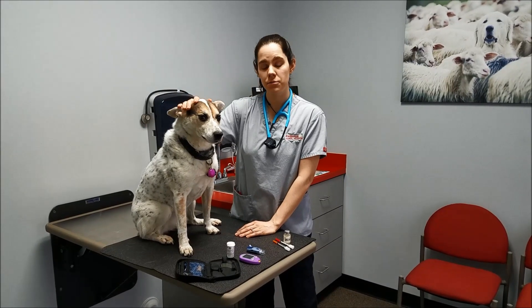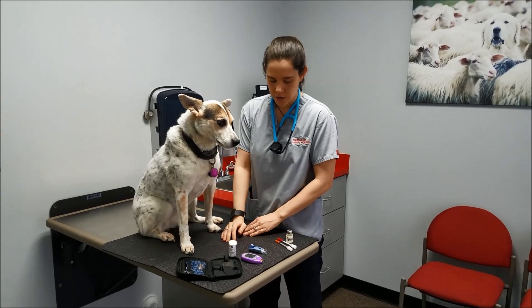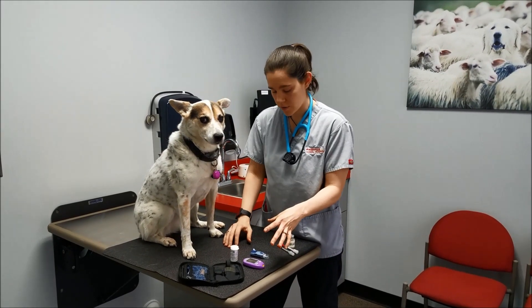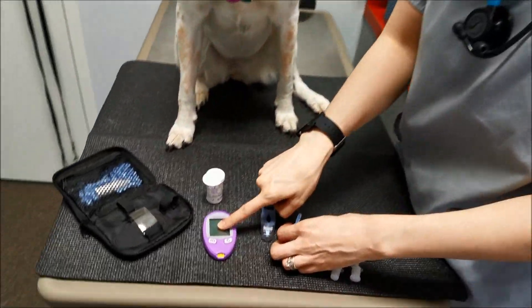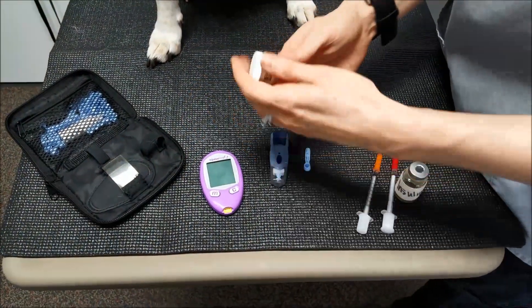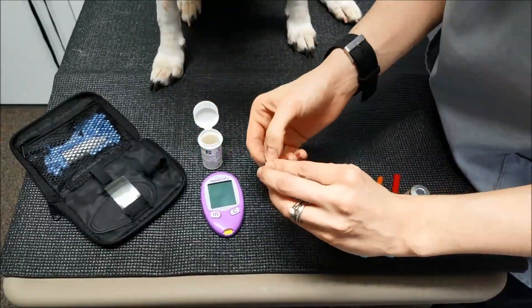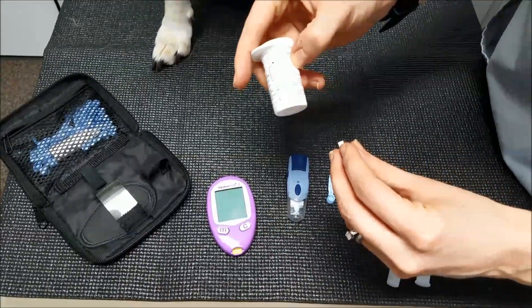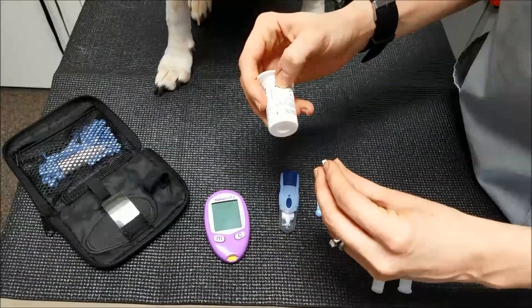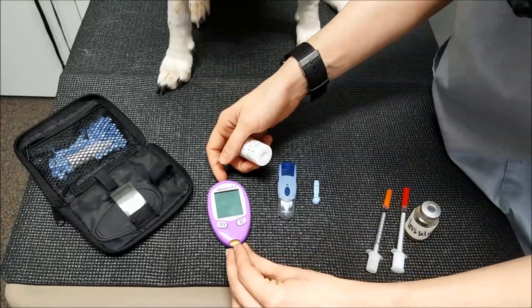We have Bandit here, and we're going to be doing a blood glucose level for her. We have all of our utensils out: we have our Lancet, we have our Alpha Track Glucometer, and we have our test strips. You want to make sure the test strip is set to the right number, because if it's not set to the right reading number, it's not going to be an accurate reading. So you want to make sure it's either on dog or cat, depending which pet you have.